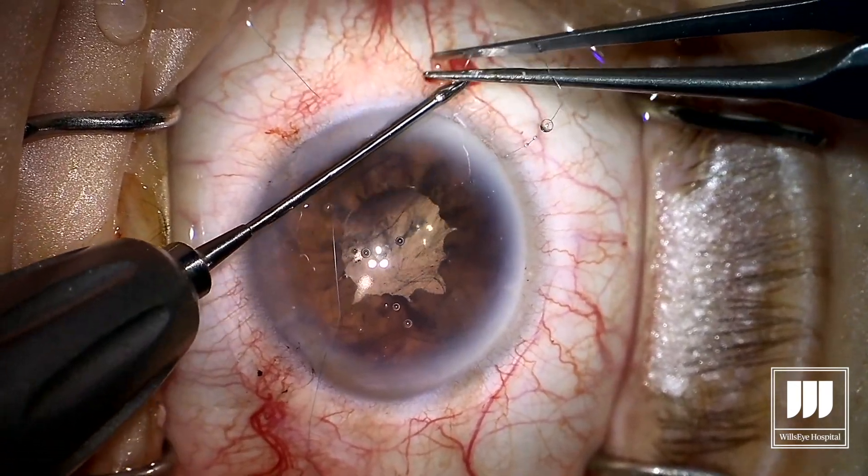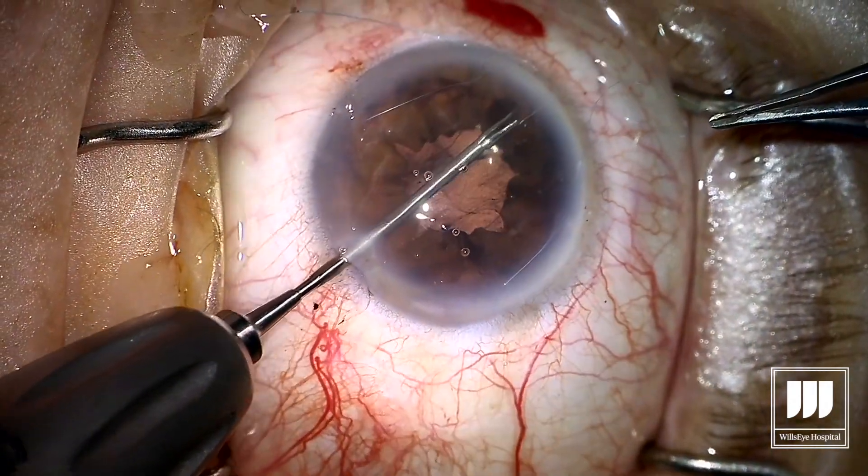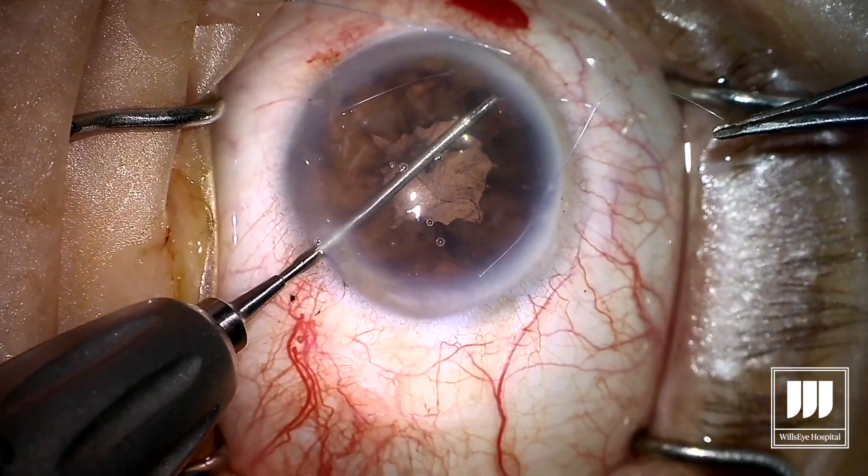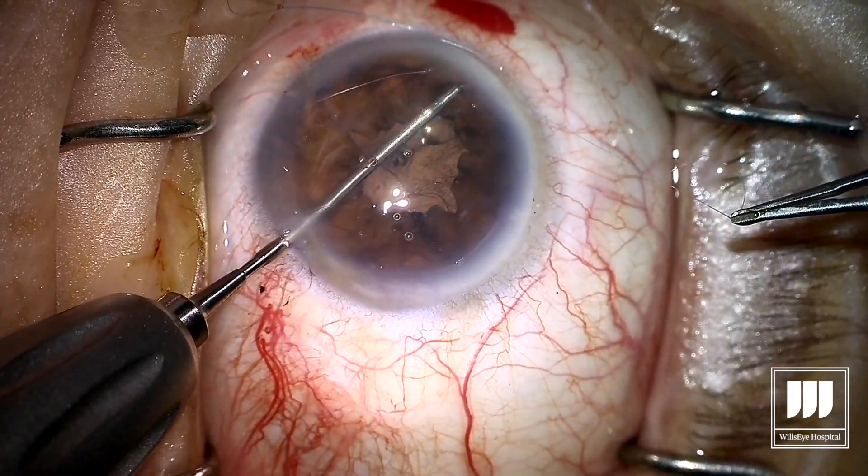Since this is a 3-1-1 suture, you've got to repeat that motion two more times, each time throwing the single throw and then grabbing one suture outside the eye, the other inside the eye, and tightening up your suture.